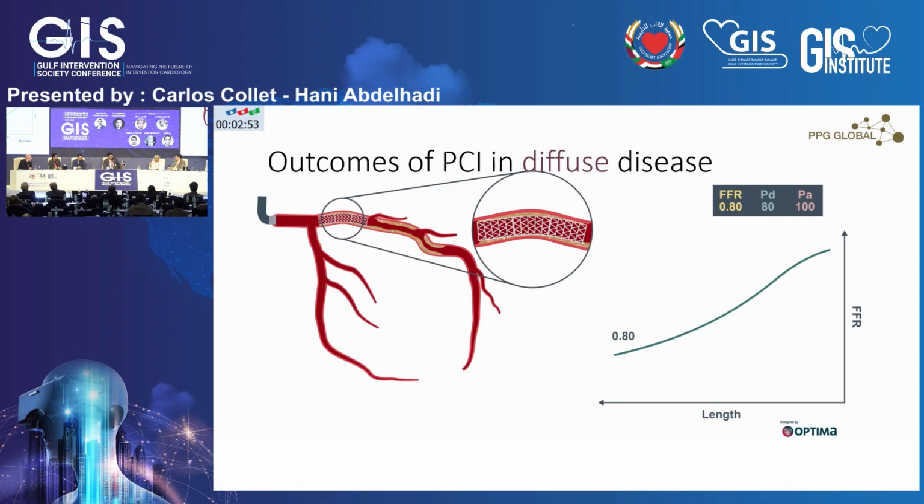Yeah, so very nice case, Hani, you present. So just one question. When the patient came actually the first time, pulmonary edema, everybody will think this is left main kind of disease. And we saw in the image, there was some kind of distal left main, but in the IVUS, there was only ostial LAD. So I don't know whether, did you interrogate the circ as well from left main to circ just to see if there's any disease, because twice pulmonary edema, although ostial LAD, it's maybe kind of left main equivalent disease from the clinical presentation. I was wondering whether the ostium of the circ was fine.